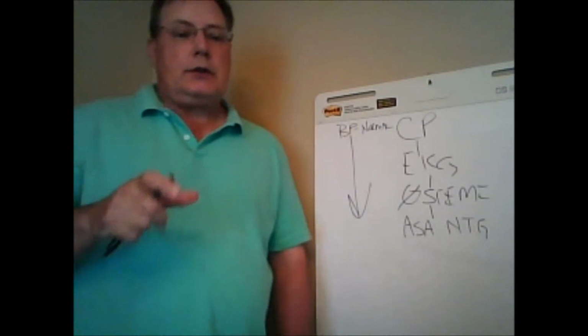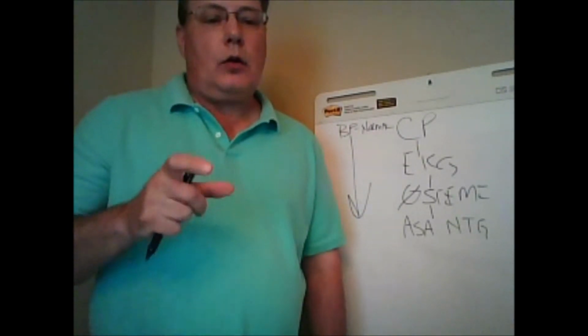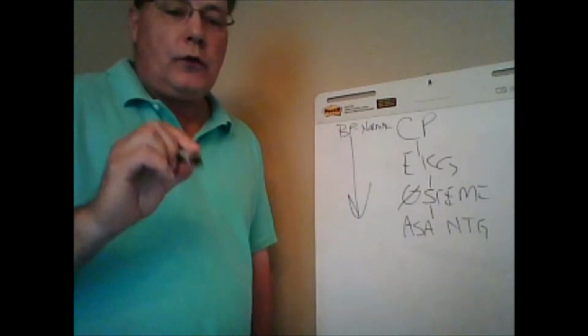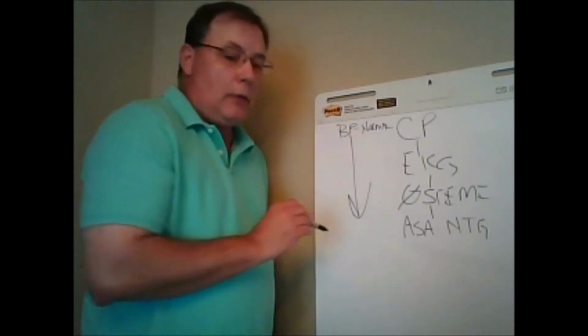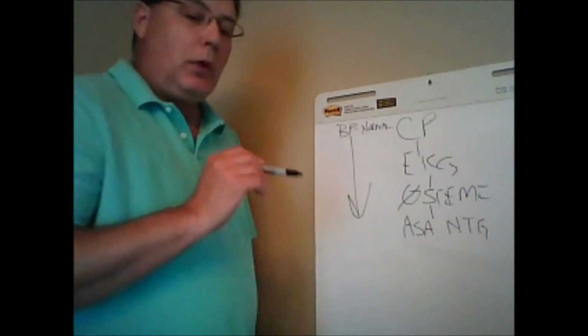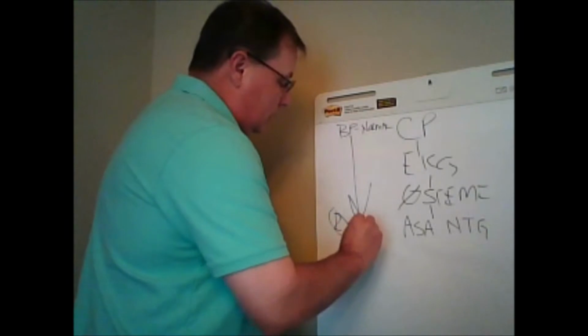Very, very small percentage, about 3% of all heart attacks, are isolated right ventricular infarcts. But a clue for right ventricular infarct is that sudden drop in blood pressure. So anytime you have a patient that has that sudden drop in blood pressure, you should do a right-sided EKG.